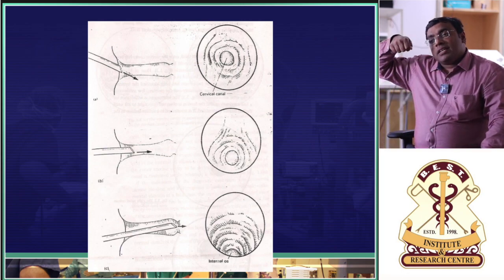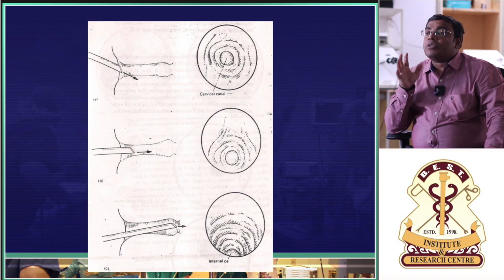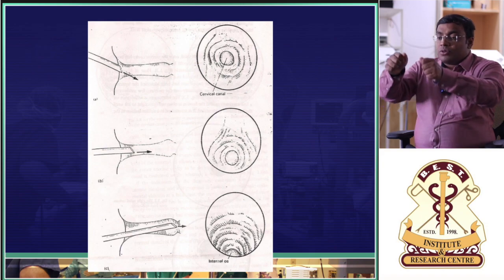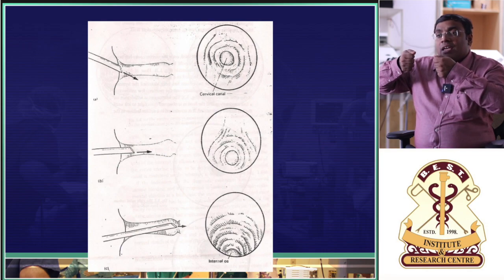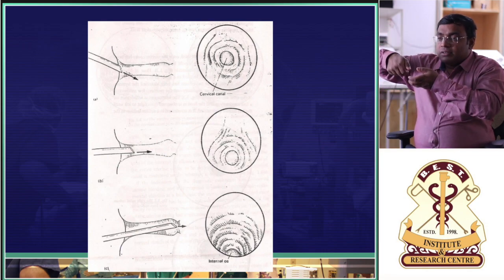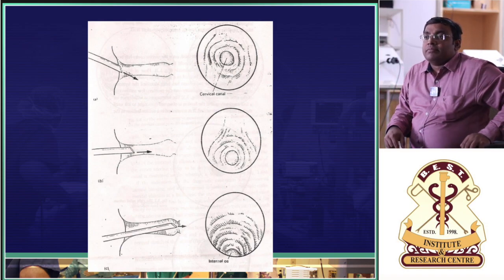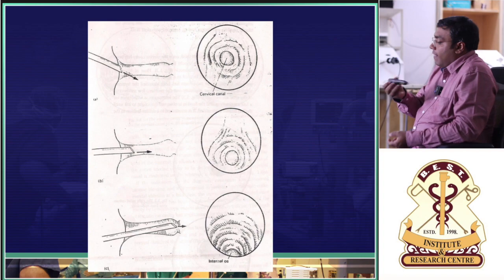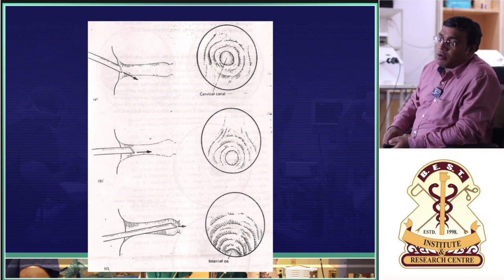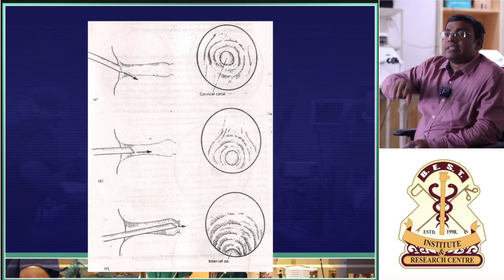So the direction in which you move your hysteroscope is like the reverse of an outlet forceps. For forceps, what do you do? Sacral hollow is like this. So first is downward, forward, and then upward. Do the same in reverse. So upward, forward, and then downwards. You are in the uterine cavity. Okay. So that is what you should do. So the light cable has to be at 6 o'clock position, so that the cervical canal, that is the black hole, is seen at 6 o'clock position.